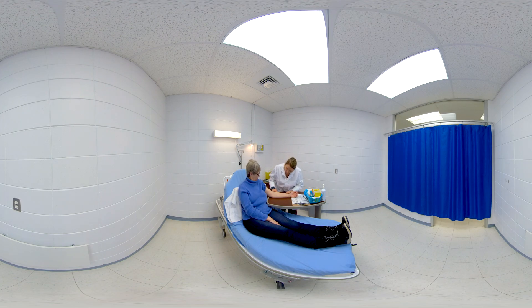The technician ensures that she has the right tubes for the request and that they are placed according to the recommended order of collection. She then makes sure the patient is well positioned and comfortable, and checks for a good size and straight vein. Knotted and indurated veins must be avoided at all costs. She chooses the needle gauge according to the vein size, checks the puncture site, and places an underpad under the patient's arm. The elbow crease is the appropriate place for a blood sample, and the work surface must have been disinfected before the arrival of the patient.